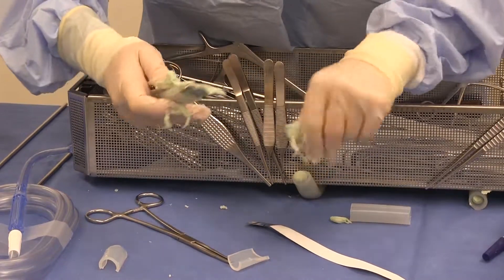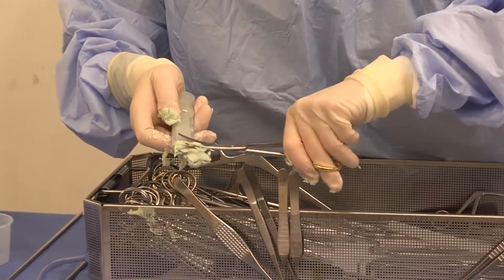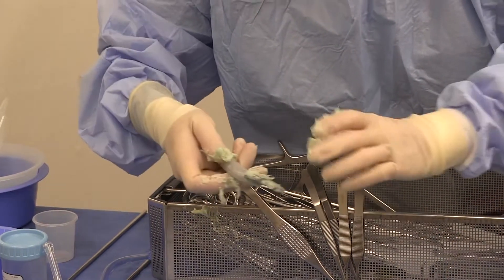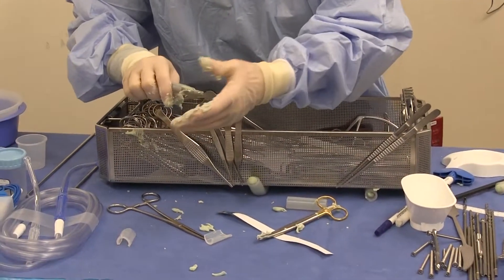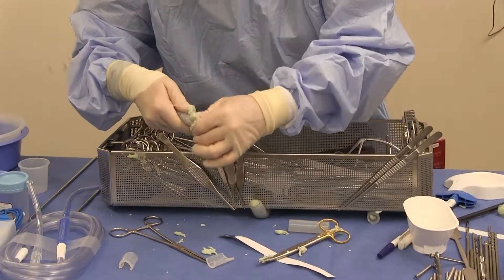So this is coming along and it's getting doughy. It's pretty good here with the coating. You can use your scissors to trim because it is getting doughy. If you need to, change your gloves, because it's hard to work with the cement once it gets stuck on your fingers. I try to get this done before the case actually starts, because then I'm not waiting for the cement to get hard.